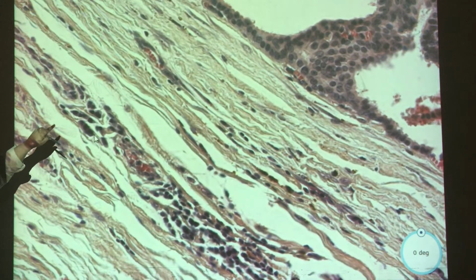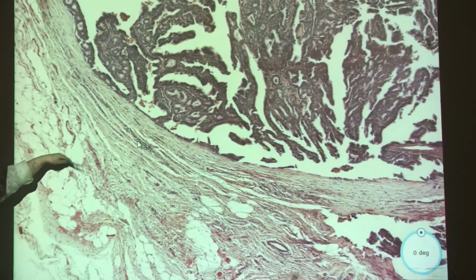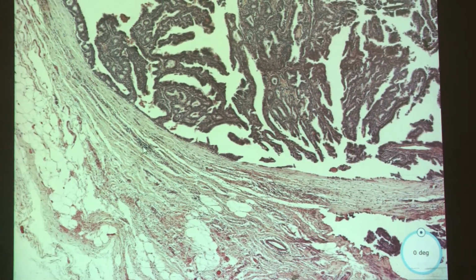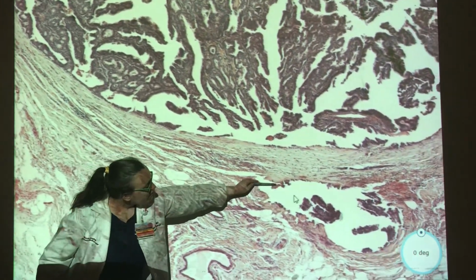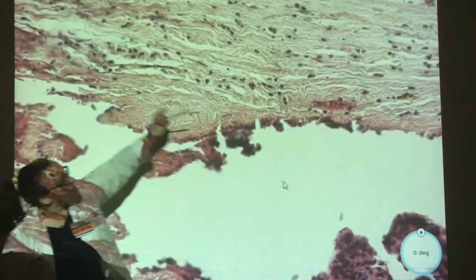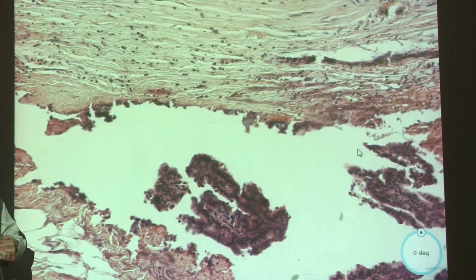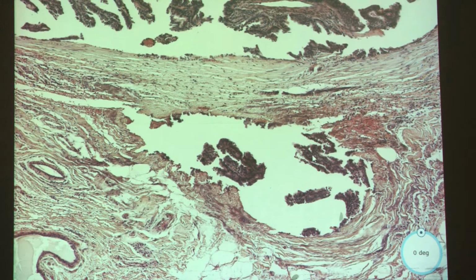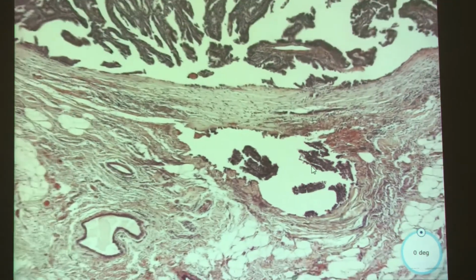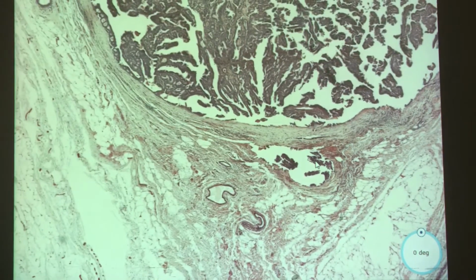Some of them are, but if you zoom out, you kind of have a capsule, right? And it's poking through that. Okay, so this little area down here, this is enough, right? Because your main lesion's up there. Yeah, this is coming through. There's some cells that just kind of percolate through, like you saw. Yeah, so this would be invasive.